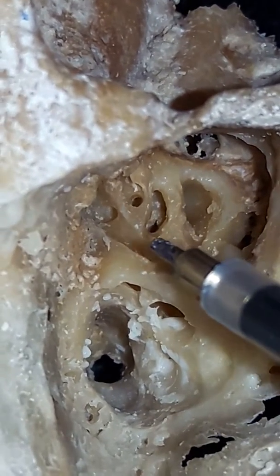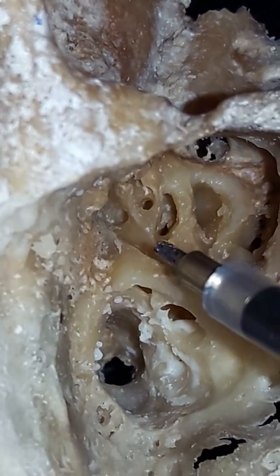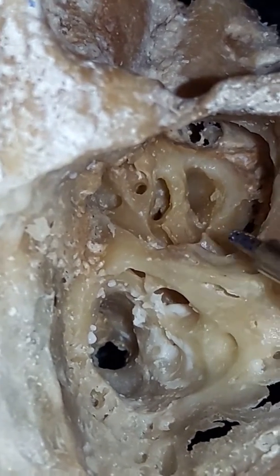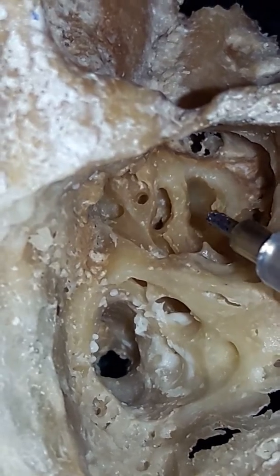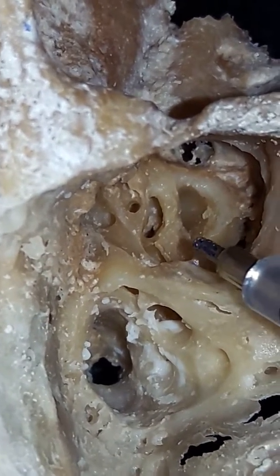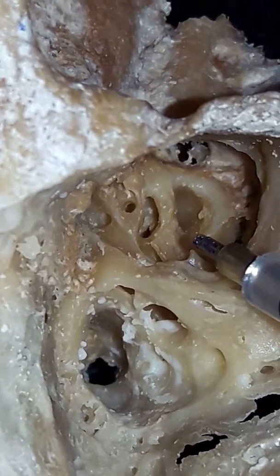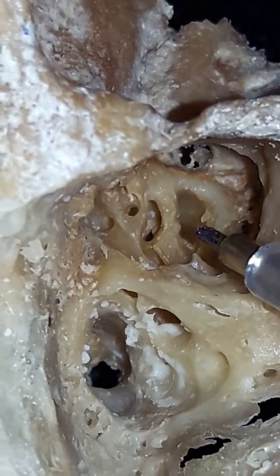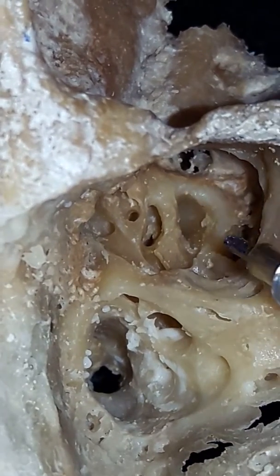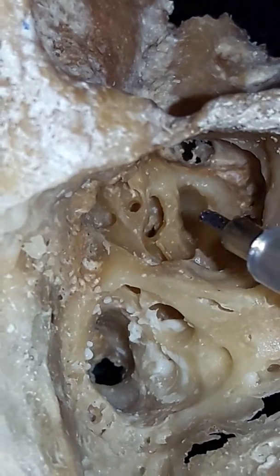And this is the oval window. First we have to do a scala tympani cochleostomy at the antero-inferior part of the round window, and if you drill that out in the direction of the outer wall of the cochlea, it becomes the scala tympani drill out.